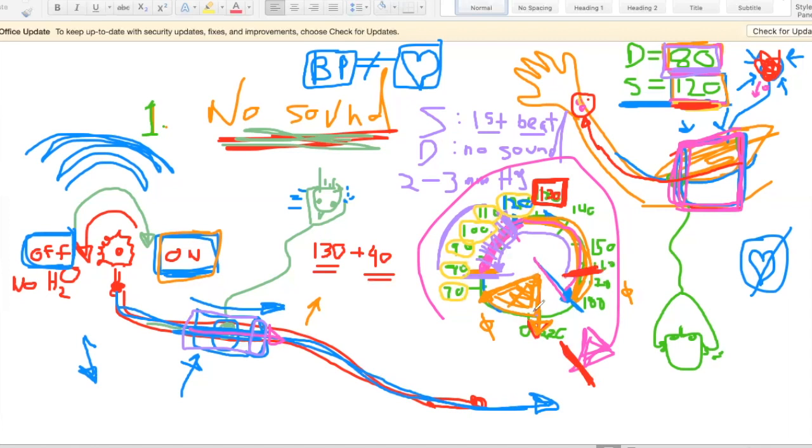Now, 170 millimeters of mercury for this individual is still going to be high enough for the sphygmomanometer to be tight enough to not hear the blood. It's going to be high enough to overcome the systolic blood pressure, and the individual's not going to have blood flowing underneath the stethoscope. So there's not going to be any noise. And I've saved pumping unnecessary air and discomfort all the way to the end of the manometer.